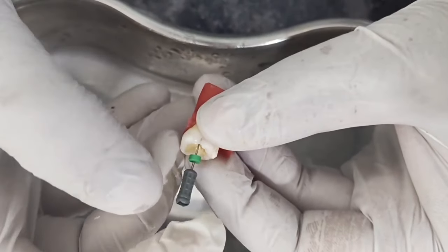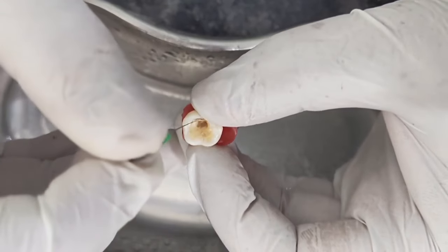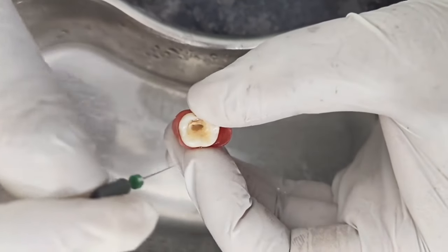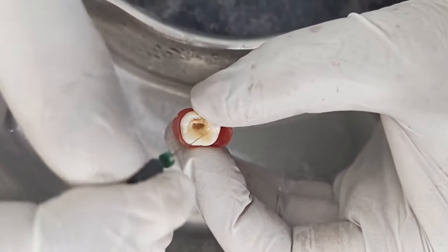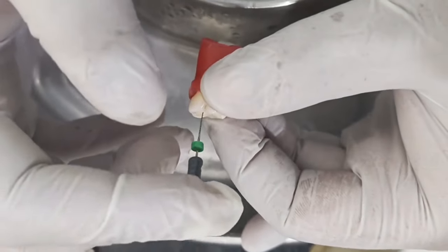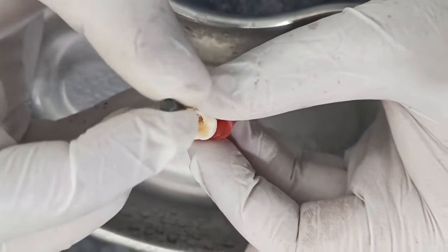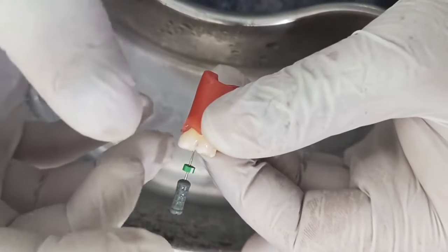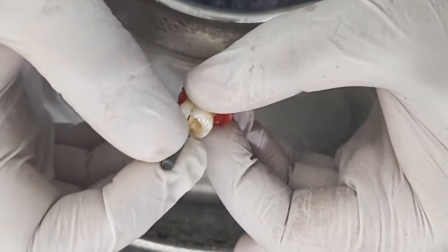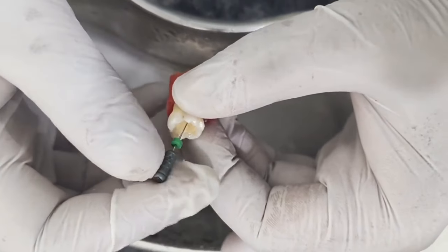What I do in my practice is, after filing with the number 8 file, I give a copious amount of sodium hypochlorite 5% into all the canals, and before giving that, I place cotton on the lingual side and the buccal side of the tooth, and I isolate the tooth properly. Then only I start the irrigation. Many people ask me why there is pain in the second sitting of RCD. The problem is that during the first sitting of the RCD, you have not irrigated well. That's why it happens. If you irrigate properly in the very first sitting, there won't be any kind of pain in the second sitting of RCD.